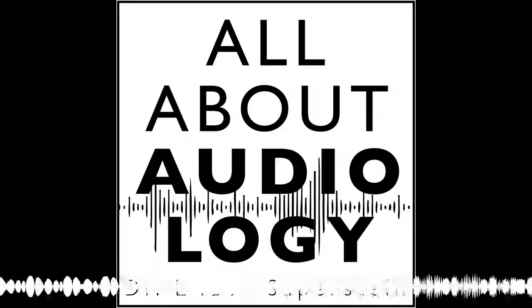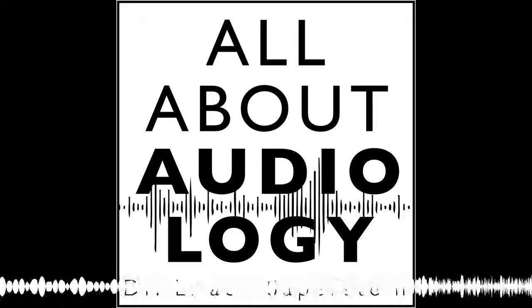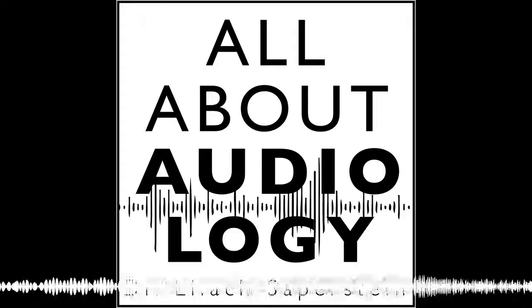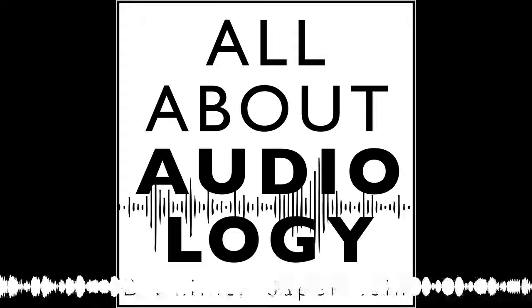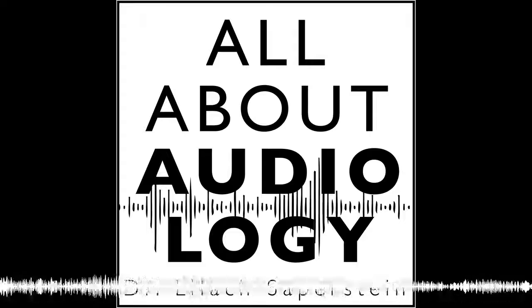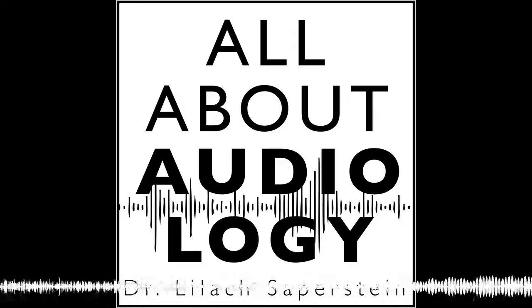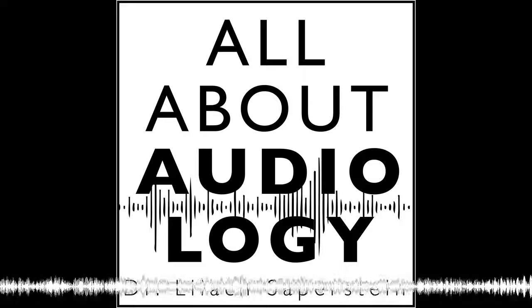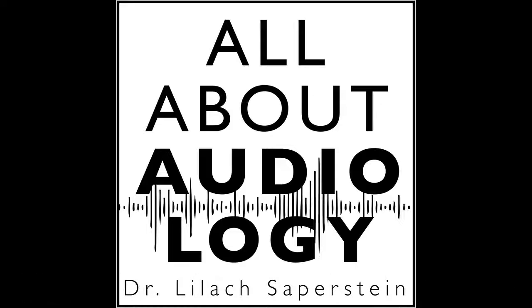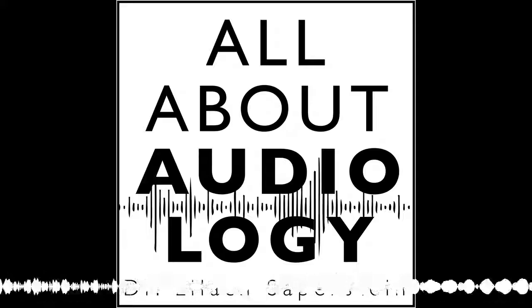And then at the end, again, we'd listen to the exact level they could hear. And then they would hear the level that they could hear. Oh, I can hear it at 20. They can't hear. You can't hear it there. Like, no, this is where we stop. And then you have commitment and you have knowledge and you have buy-in by the parents. And like I said, nothing made me more satisfied, as hard as it was, than to turn around and have them tell me the result before I could show it to them. That is amazing. And that's what I like to do, because I want them to be a part.